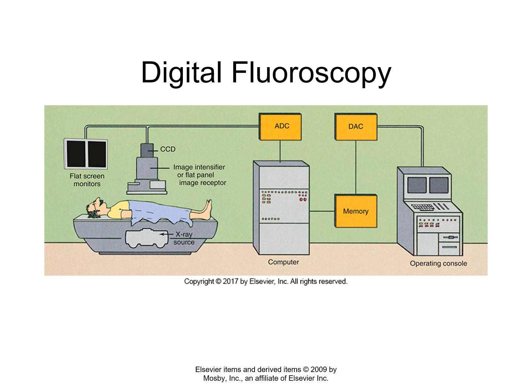It's the light sensitive chip behind your camera phone lens in your cell phone camera. Okay? So it's sensitive to light. It doesn't catch X-rays. The flat panel image receptor does the job of both the image intensifier and the CCD. And so that's part of the reason I don't like this illustration: it omits that detail that you don't need a CCD if you have a flat panel DR or digital fluoroscopy system. Okay?